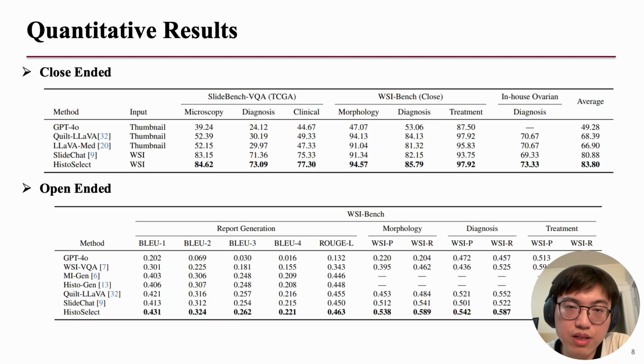We evaluate our HistoSelect on three different datasets: SlideBench VQA, WSI-Bench, and our in-house ovarian dataset. Our HistoSelect achieves better performance in both closed-ended and open-ended tasks.